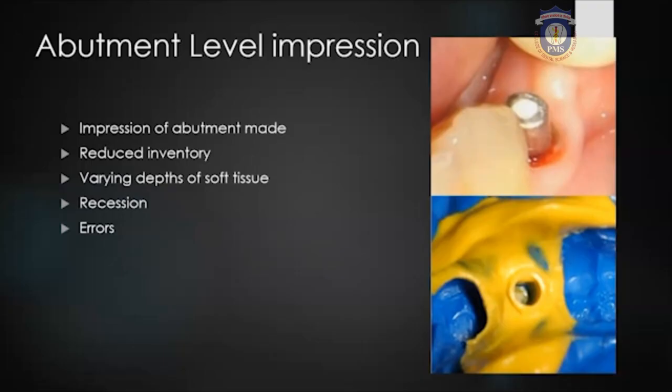So what the abutment does is it brings the connection from within the bone through the gingiva into the oral cavity. In this technique, we place an abutment on the implant and tighten it in the patient's mouth. And then, as we would take impressions for any crown and bridge, an impression is recorded.